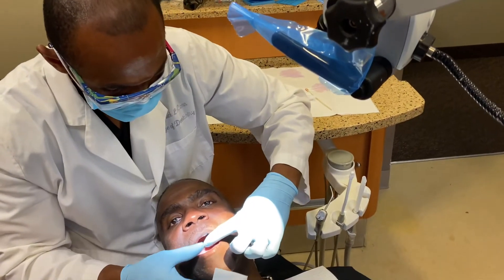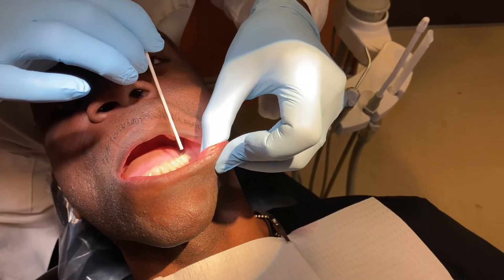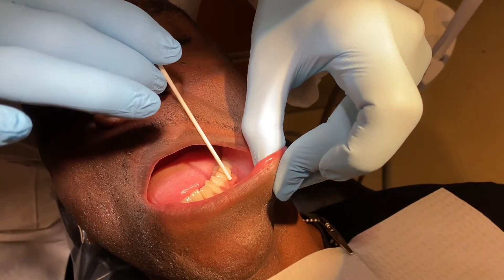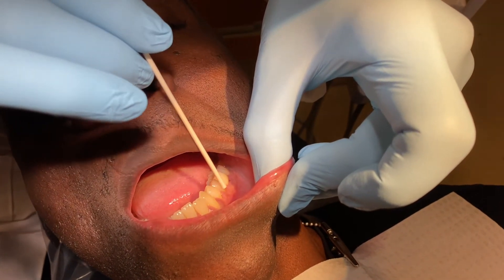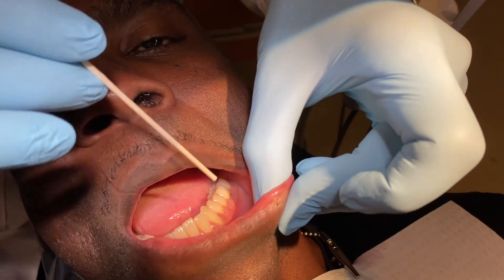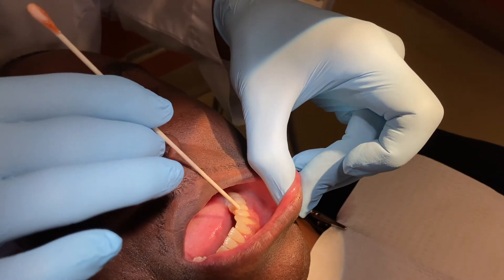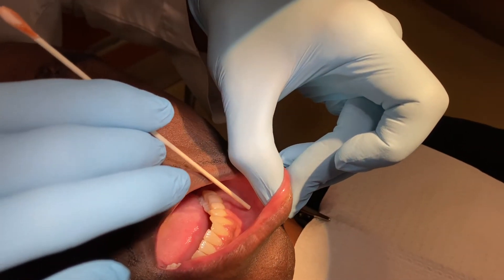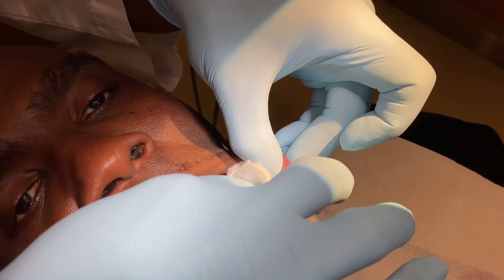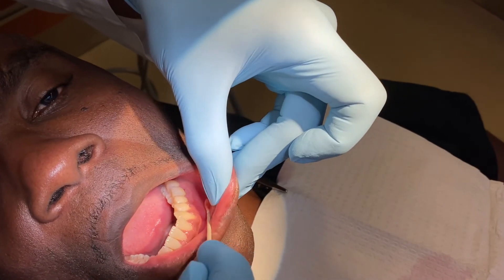The technique is pretty simple — we're going to aim for the depth of the vestibule. Here's my second premolar, this is my first mandibular premolar, and I'm going just slightly distal of the first premolar, almost in between the first and second premolar. You can easily aim for the center of the two premolars. The mental block is a fairly easy block — you can go right in the center of the premolars into the depth of the vestibule and bury your 30 gauge short needle and you will not miss. I'll dry the tissue and place my topical anesthetic.